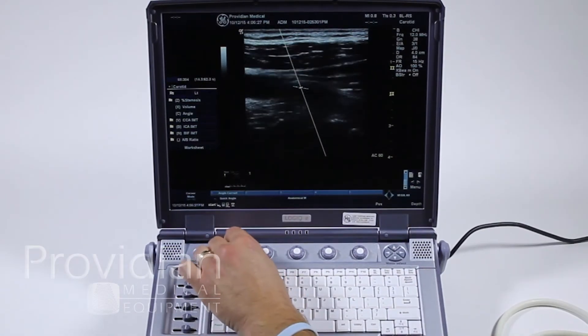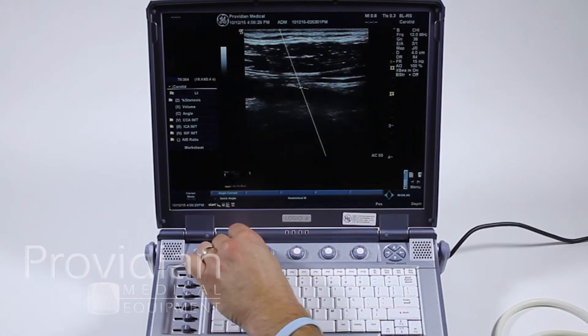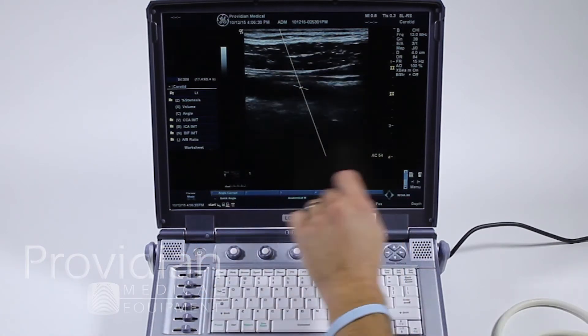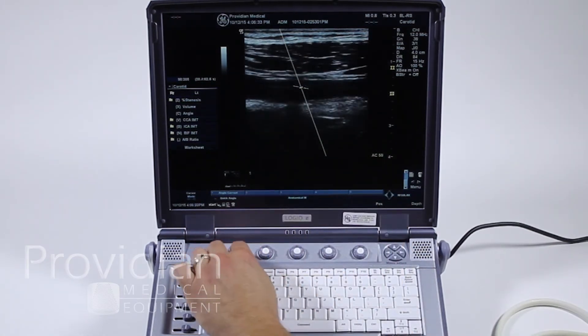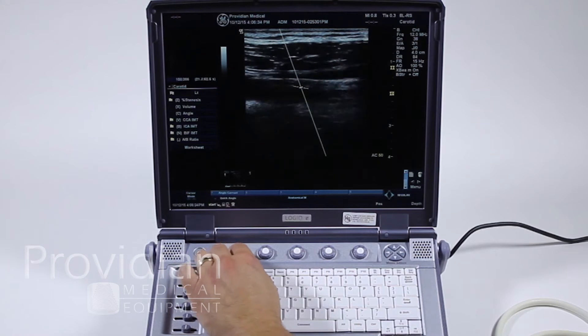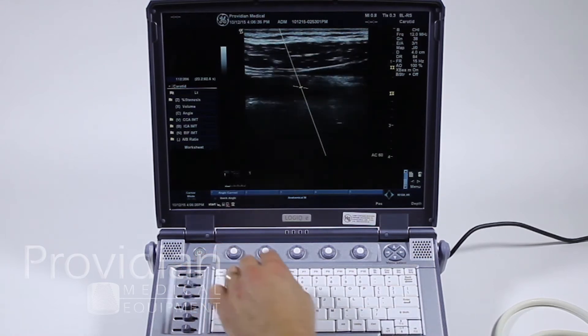You can also use our angle correct. Notice your angle is shown right here. And quick angle — adjust it quickly by 60 degrees.